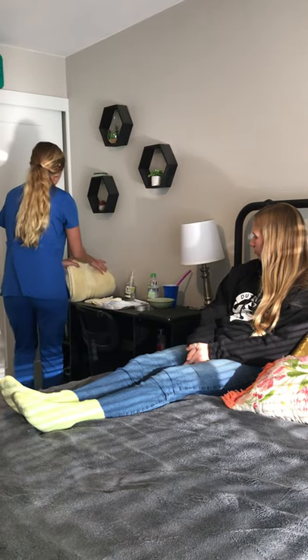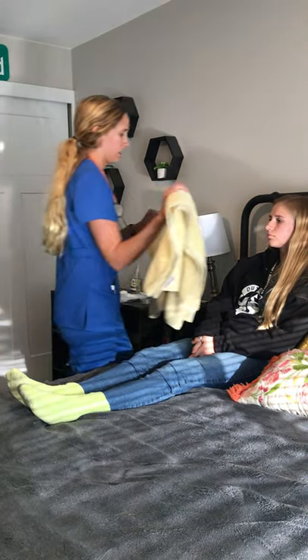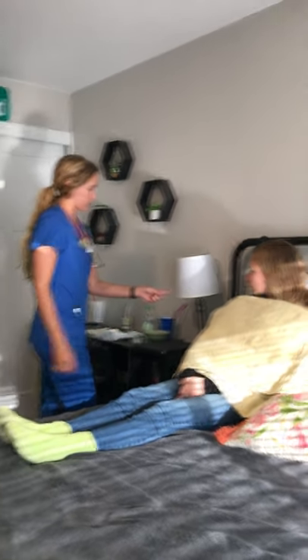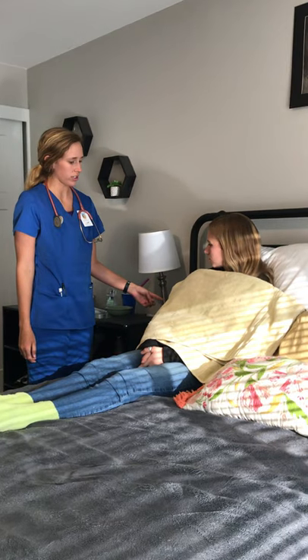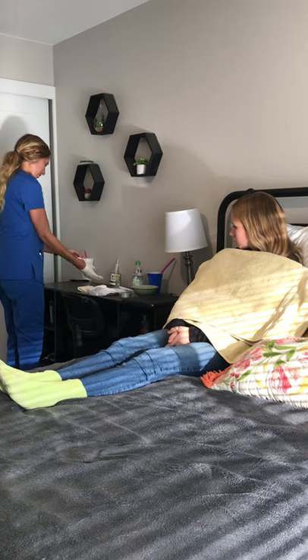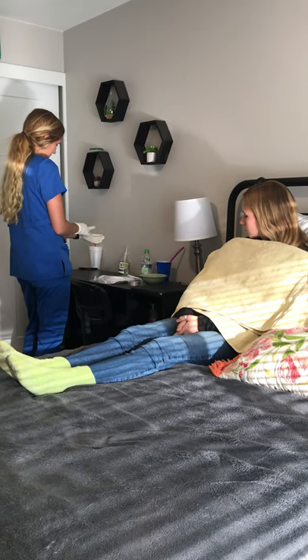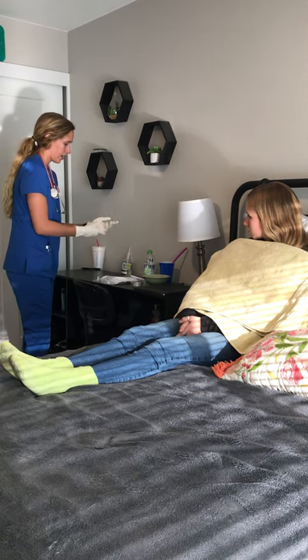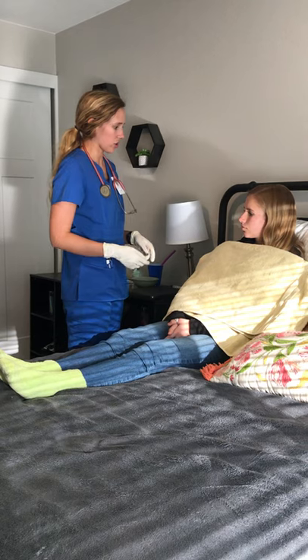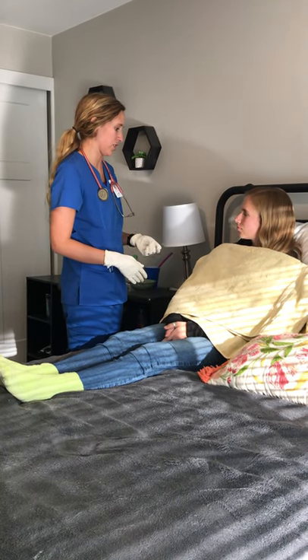I'm going to lay this across from you because I'm going to be putting an NG tube in, in case we get any leakage. I'm going to raise the head of the bed to at least 45 degrees or higher. Putting on my clean gloves. I'm going to check each nostril to see which one has the best airflow — that's the one we'll use for the NG tube.